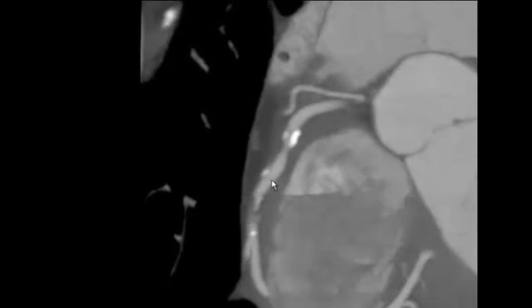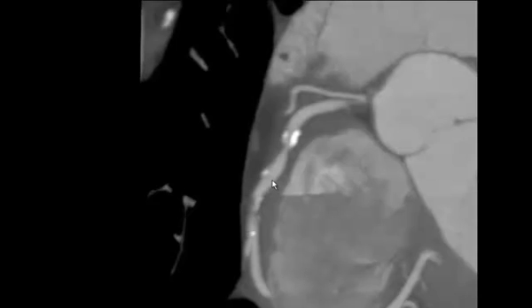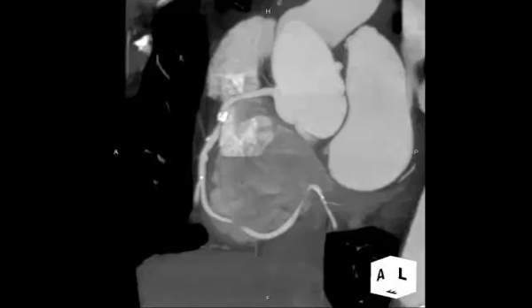This choke point appears to represent a severe narrowing of the lumen, quite likely representing obstructive plaque to at least a moderate degree — that is to say, the apparent area of diameter reduction here is greater than 50%. Here is a short axis view of the dominant right coronary artery showing this mixed density plaque, strongly suggesting the likelihood of functional significance.